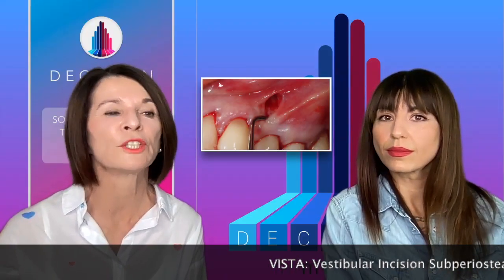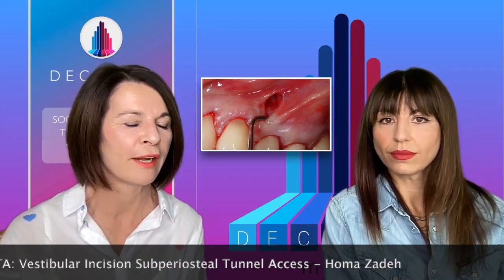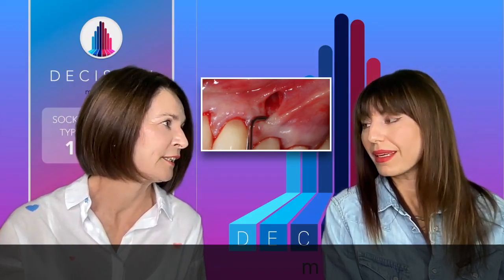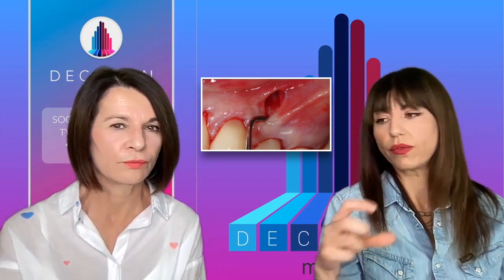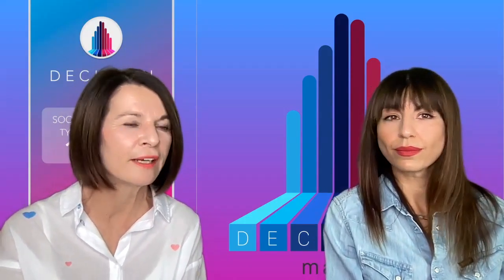In VISTA, the vertical incision in the vestibulum is not utilized only to introduce the connective tissue graft; it is utilized to prepare the tunnel. I know that you know about the VISTA technique. It is useful when the width of the keratinized gingiva is really high.